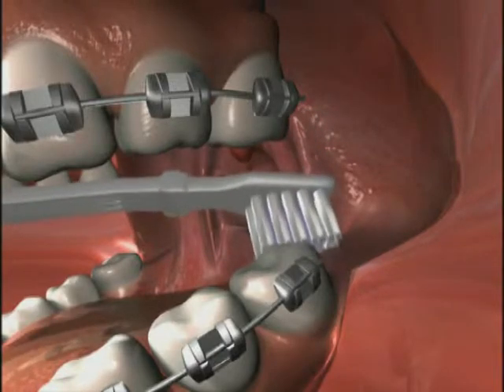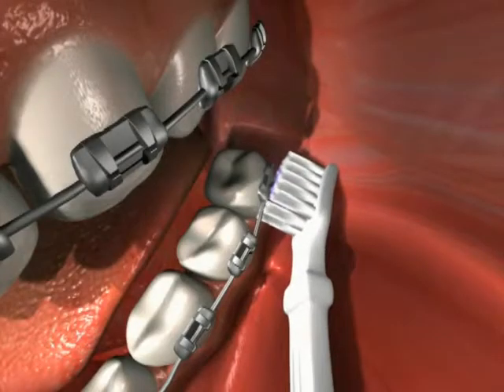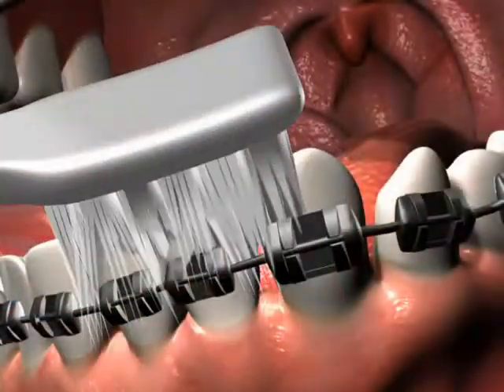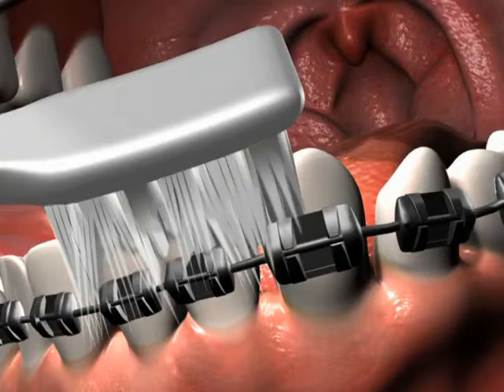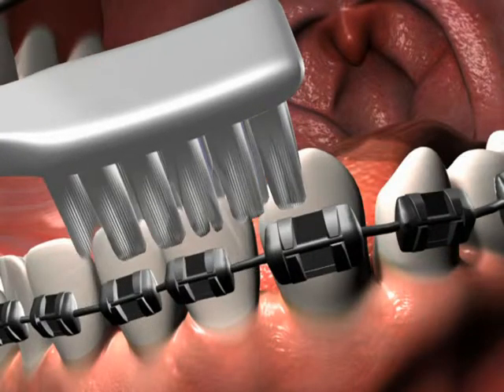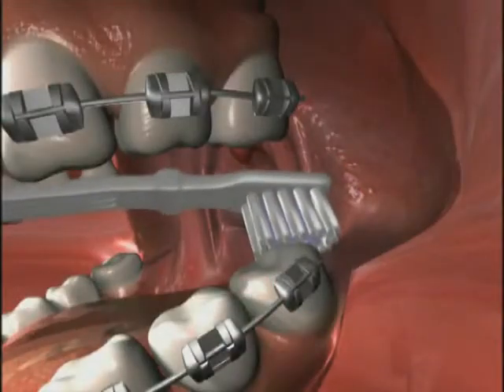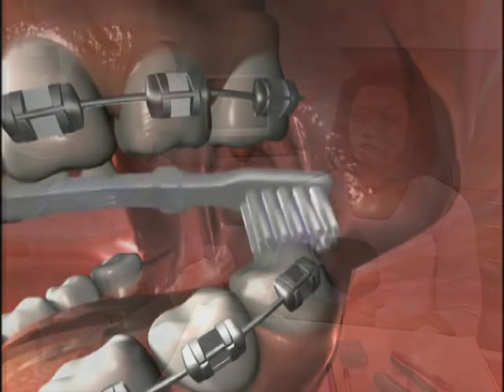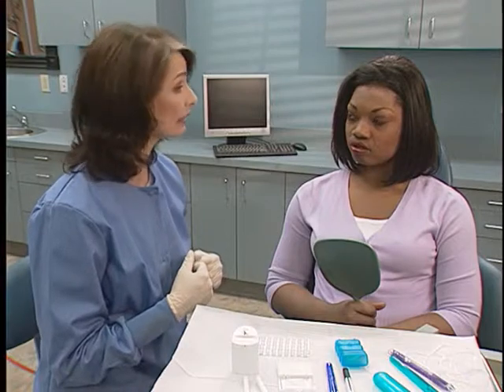Brush the same way on the bottom, carefully brushing below and above each bracket, carefully pushing the bristles under the wire as you work your way around. When finished, once again, brush the backs of the rearmost teeth using the same circular motions. After you brush, be sure to rinse thoroughly and check in the mirror to make sure you've gotten everything as clean as can be.